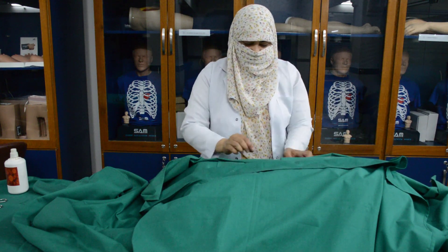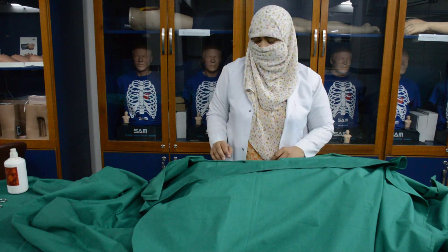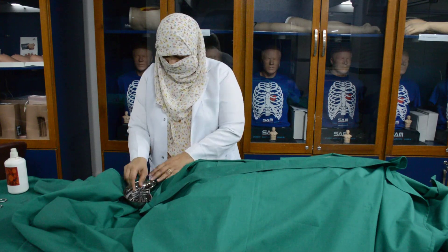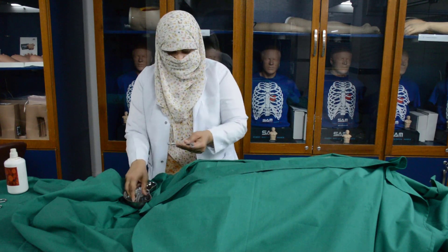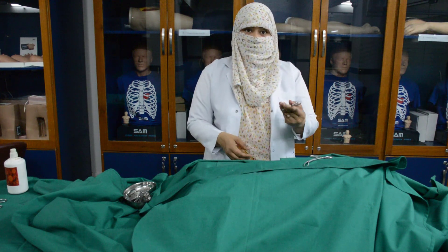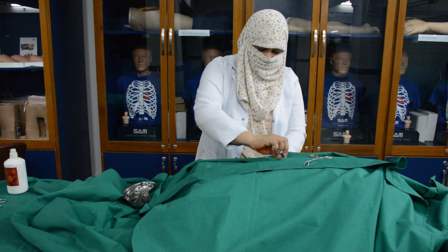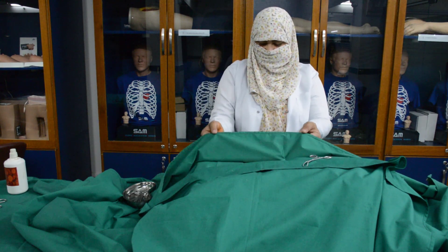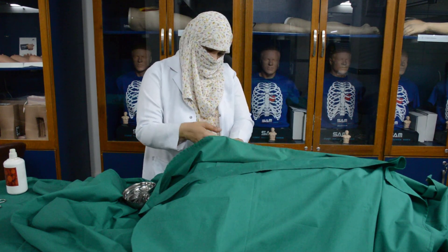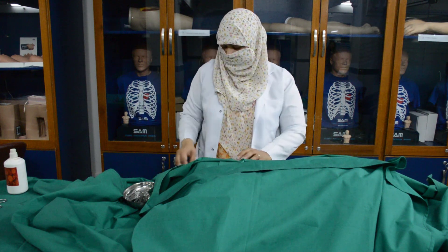Now you can see that we have left only the part that we will be operating upon. Now we have to fix the towels with the towel clips. These towel clips must not hinder our operative field, so we place them slightly inside. The other clip is placed similarly — be careful not to pinch the skin of the patient.